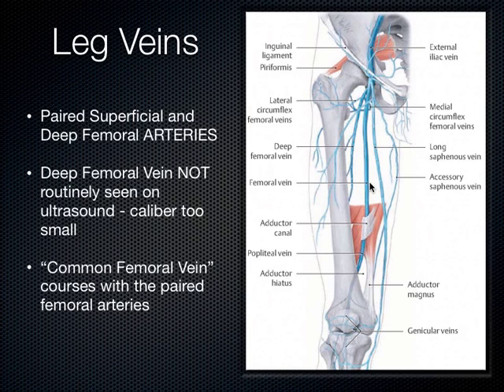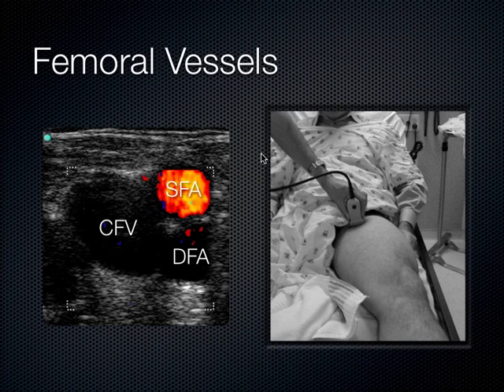But suffice it to say, it's got very easy visibility up here in the groin area that you will see today on your models, and also behind the knee in the popliteal area. So this is what it looks like.